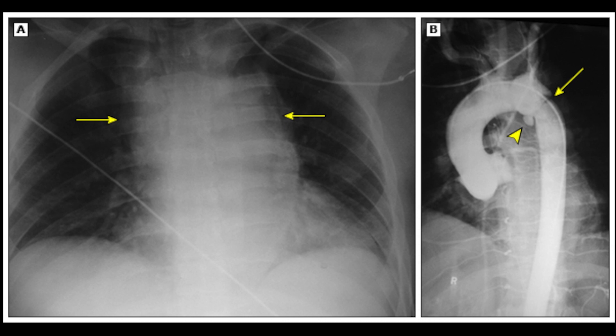In this next chest X-ray, the obvious finding should just jump out at you. You can take it systematically — the trachea is midline, no foreign bodies, no rib fractures — but this patient came in with ripping, tearing, sharp and sudden onset of chest pain radiating to the back, with a long-standing history of hypertension and coronary artery disease. Approximately 90% of patients with acute aortic dissection will have some chest X-ray abnormality. The classic finding of a wide mediastinum or aortic knob occurs in up to 76% of patients. Remember, a normal chest X-ray does not rule out acute aortic dissection.